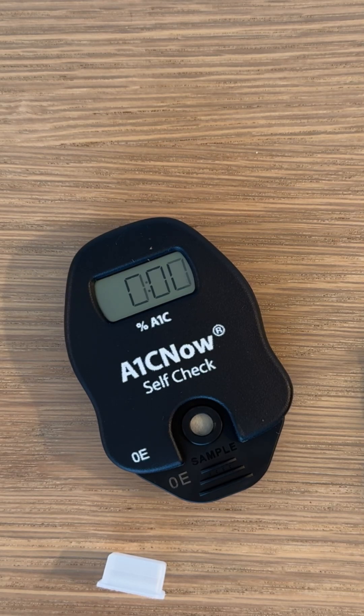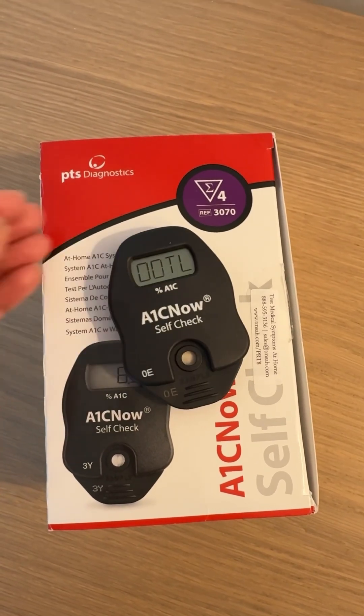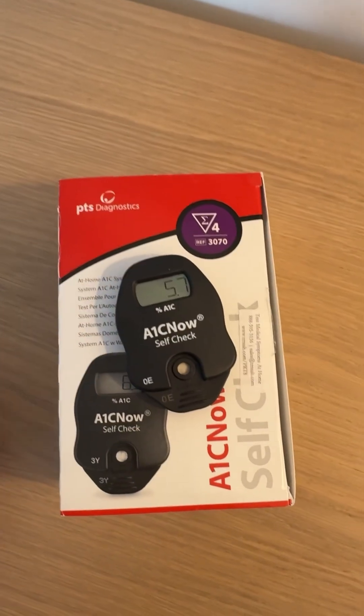I find it to be very, very similar to the A1C results I get when I go to the doctor's office. You can see right here — my A1C right now is 5.7. It's the lowest I've ever been, and today is December 1st, so last A1C of the year.